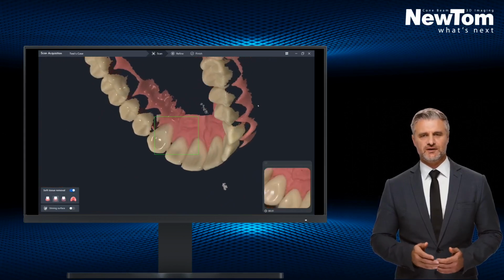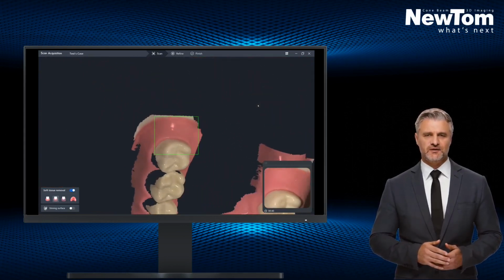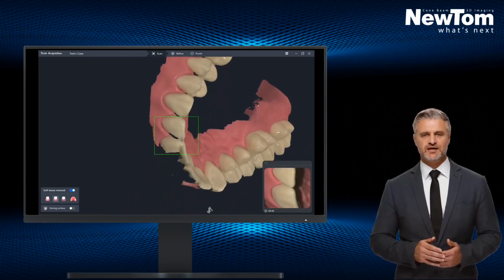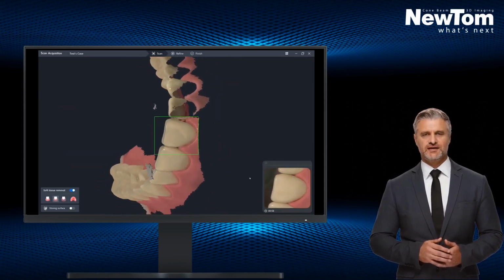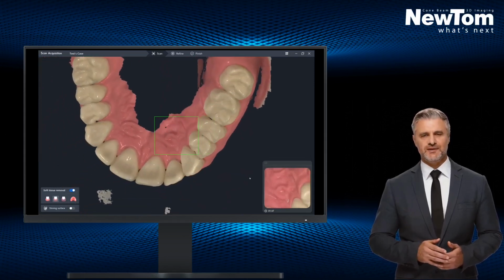Once the acquisition of the occlusal area is completed, tilt the device and scan the entire lingual area, verifying the interproximal areas. Lastly, move to the vestibular area with the same strategy, rotating the tip when reaching the front area and, if necessary, also moving to the palate.